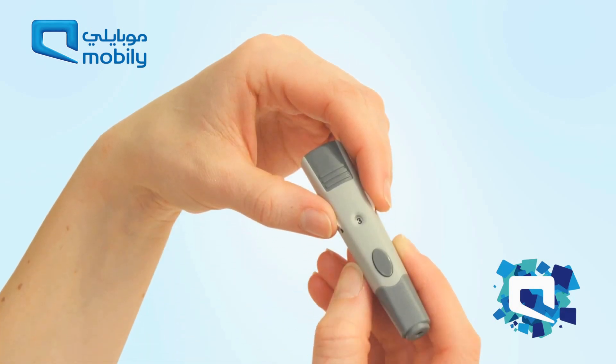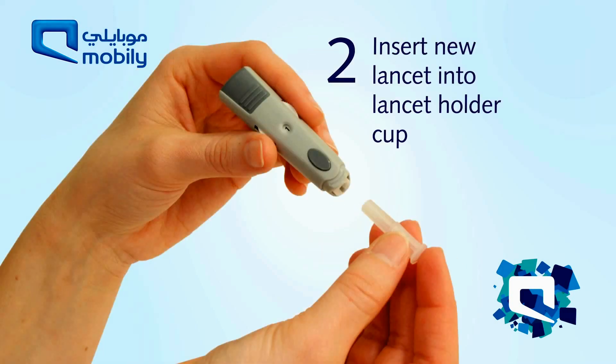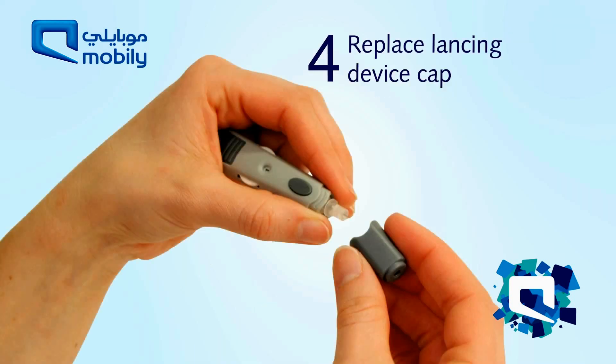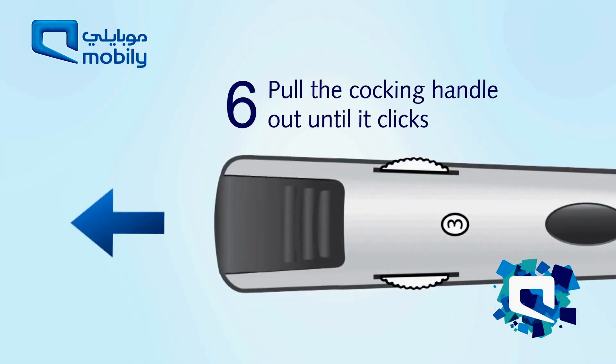Prepare the lancing device. Snap off the lancing device cap. Insert the new lancet into the lancet holder cup. Pull the lancet cap off. Replace the lancing device cap. Set the lancing level, and pull the cocking handle out until it clicks.